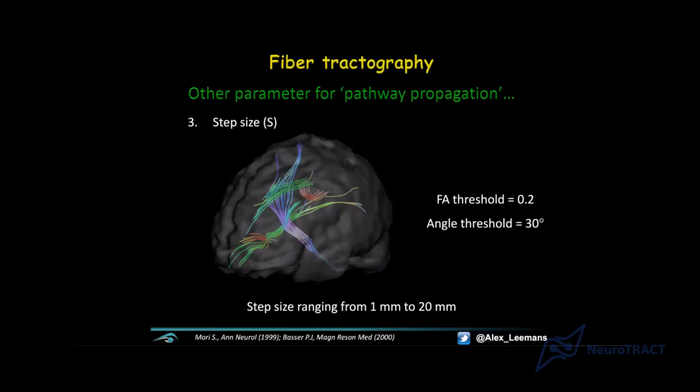Obviously, if you then follow the dominant orientation, you take a little step. And now the step size kicks in, which basically says you take a little step, but you shouldn't make it bigger than a voxel size, because if you jump over a voxel, you skip valuable information that was acquired in the data. If you take it smaller, then you will most definitely take information of the nearby voxel. So you basically follow the information. Does that make any sense?